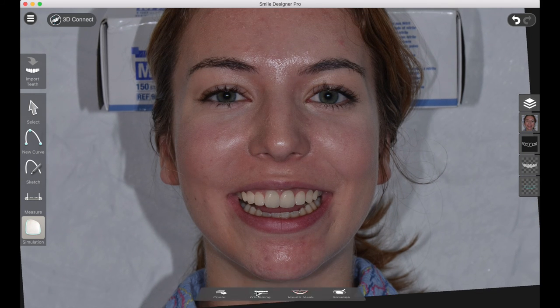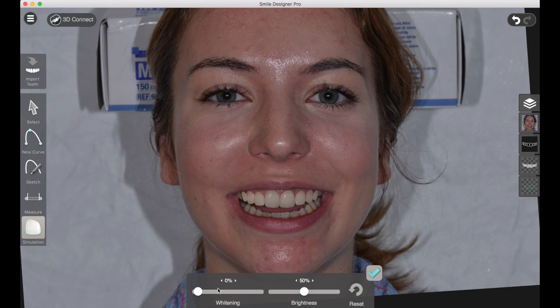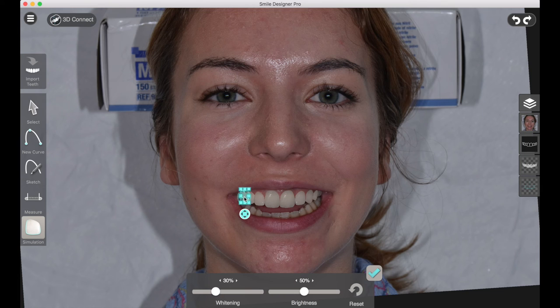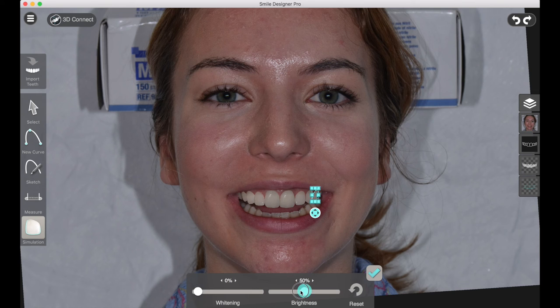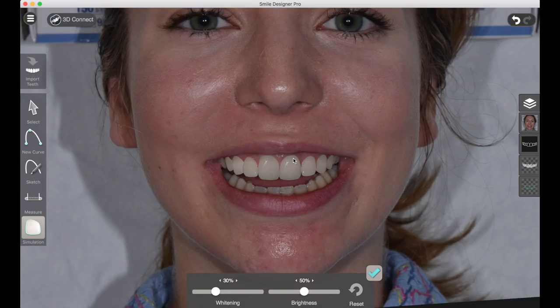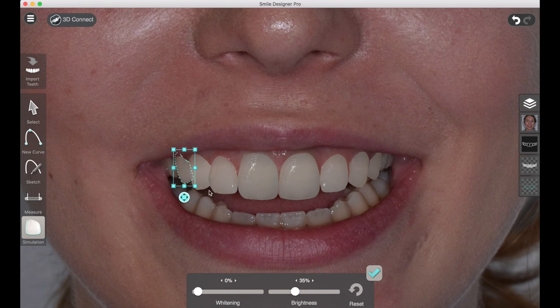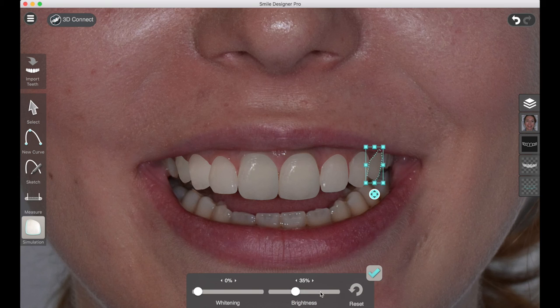Now we can go into the whitening tool, make the teeth a bit whiter, and adjust the value so it blends in with the picture. One great trick is to do the brightness or value adjustment on the rear teeth in order to get them to appear to be receding in the mouth. You can reduce the brightness on these teeth one at a time and it gives the illusion of depth.